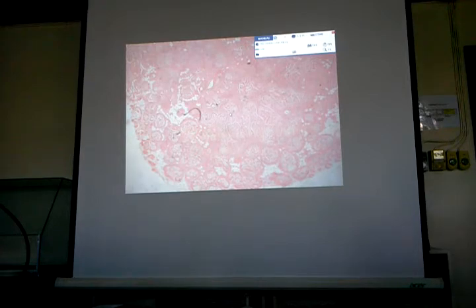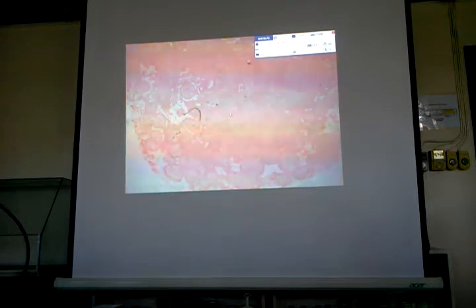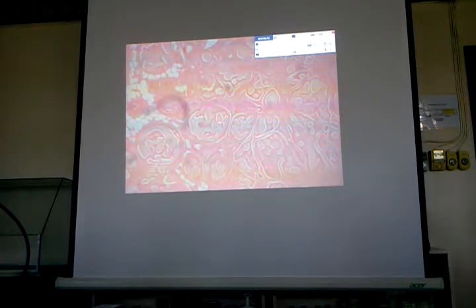The adenoid cystic carcinoma. Now, unfortunately, this slide, the stain is already very faint. However, on scanning objective view, there is a distinct pathology that is displayed by adenoid cystic carcinoma. If you can notice, there are lobules present in this tumor. And then, if we zoom in to the lobules, that is one lobule, we will be able to see numerous holes or lumen.